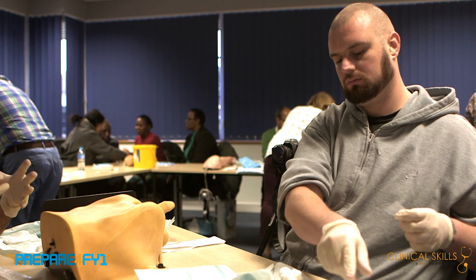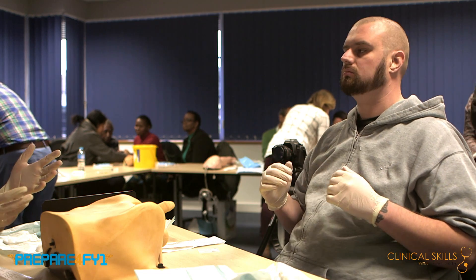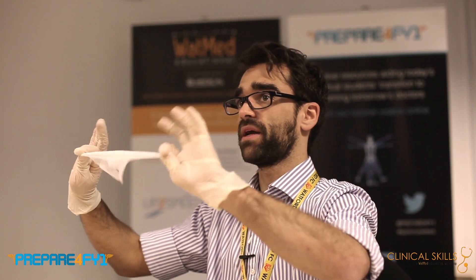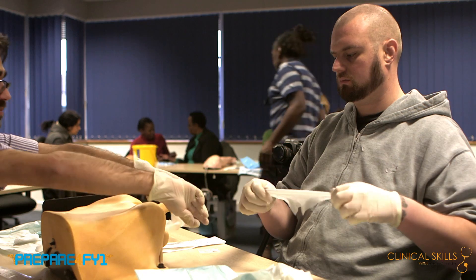In terms of doing this procedure, keep it as clean as possible. You want to keep two hands clean, and if you keep two pairs of sterile gloves on it's really helpful. Open out all your swabs on the back table completely, fold them out corner to corner — that gives you more surface area to sling around the penis.